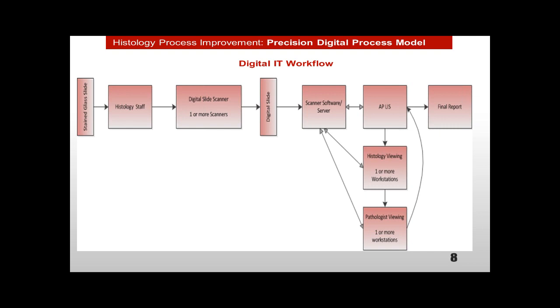Histology staff is going to have to be intimately involved in this whole process. So once glass slides come out, this is one of the big changes: instead of just turning those glass slides over to the pathologist and having them integrate information from the reporting software, the LIS, reading the slide and making that differential diagnosis, the first step in your digital IT flow is that the histology department is now integrating all that information and starting to put it together.